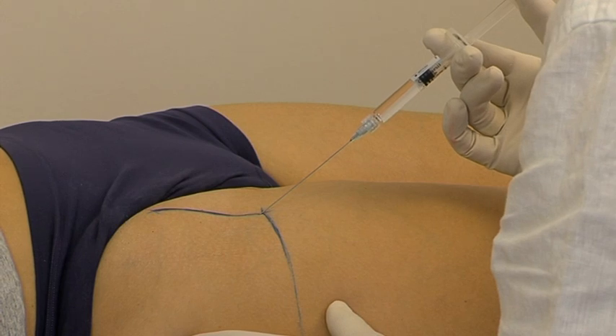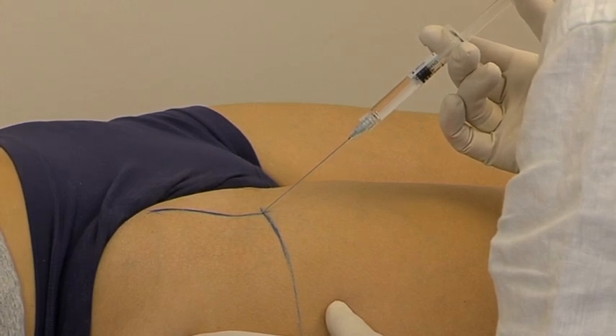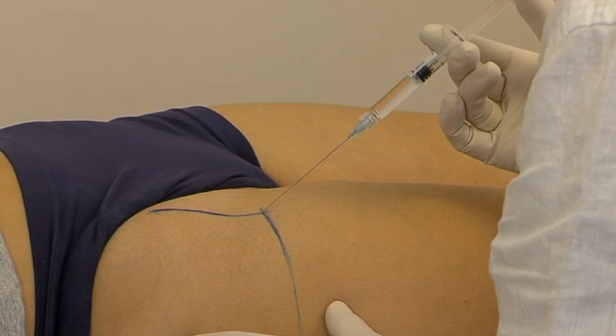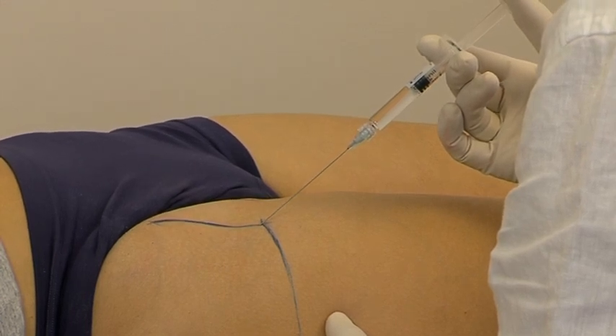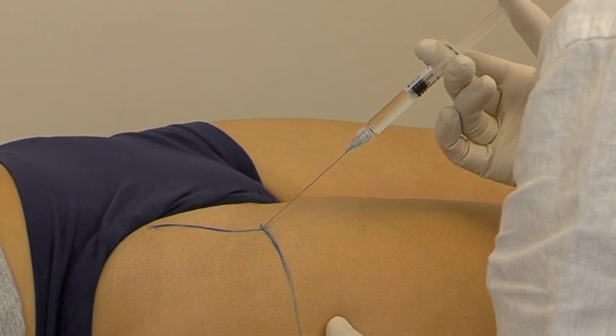One will feel the resistance of the thick capsule of the joint. Once this is traversed, the needle will strike bone close to the neck of the femur, or possibly at its junction with the femoral head. Here the intra-articular injection is given.